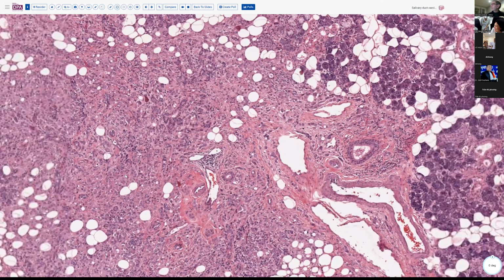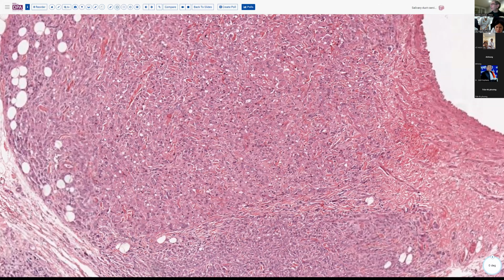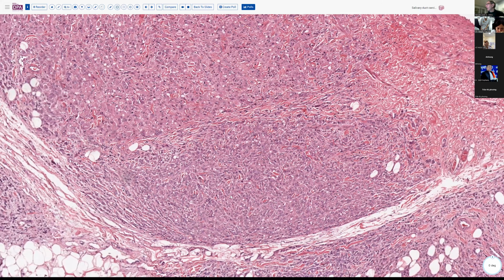As you can see, there's a destructive pattern here in this area of the tissue. And we'll go over here and look at this pattern. And you can see this is clearly an invasive lesion, high grade appearance, nearly solid growth, with some adjacent, almost spindle shaped type of pattern. So the beginnings of a transformation to almost a sarcomatoid element.